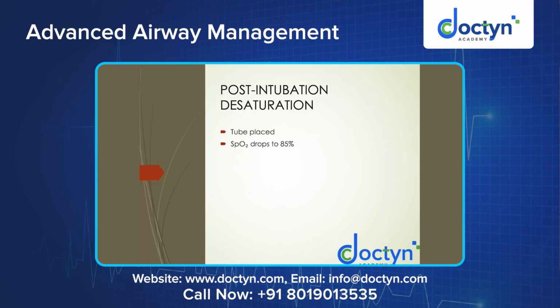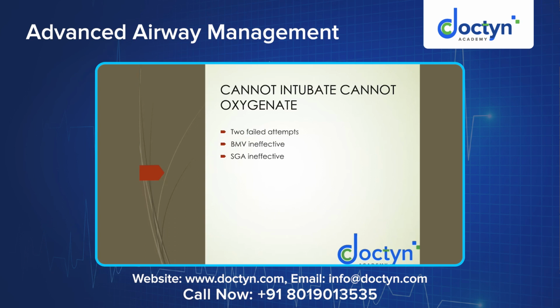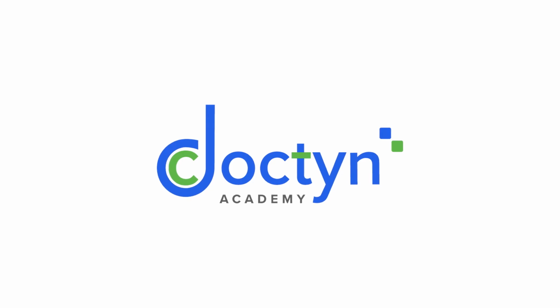Now the tube is placed, the saturation is dropping to 85% from 92. What would be the differentials? It would be esophageal intubation, it would be endobronchial intubation, it would be displacement, like the cuff is slightly out. For each thing, check EtCO2, auscultate, withdraw the tube, reconfirm the tube. So this is how you do it.